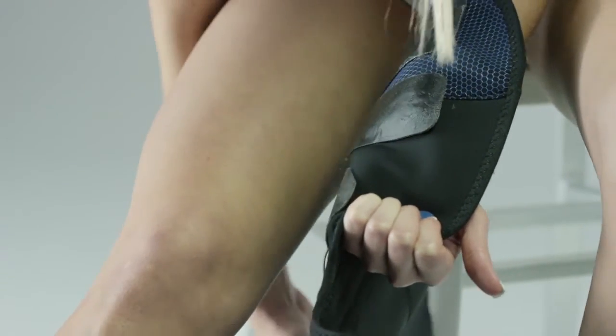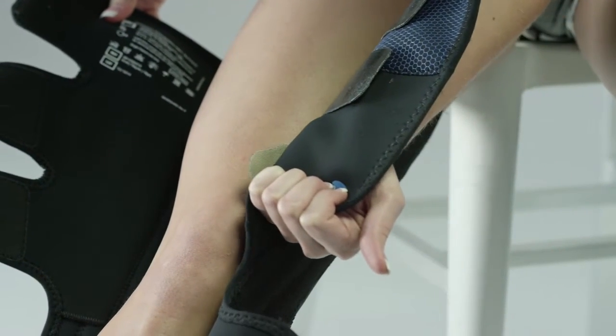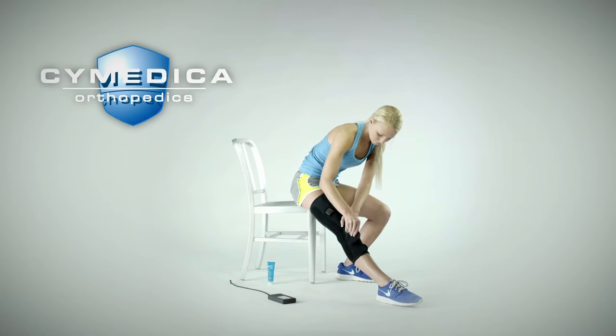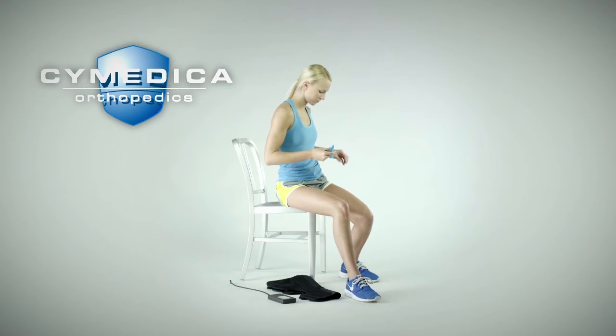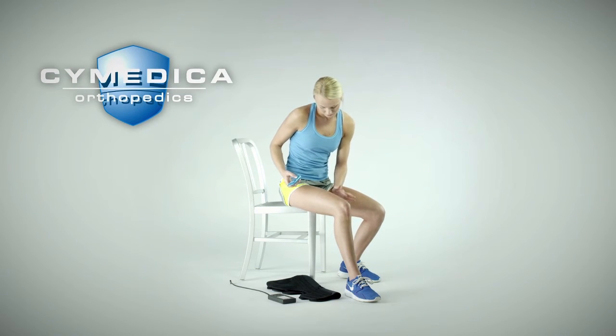The wire can be tucked back into the exit hole to remove any excess wire length. Once electrodes are positioned appropriately, tighten and secure the three wrap ends on the thigh portion and the two wrap ends on the calf portion. When ready to apply the NMES stimulation, wash and dry the skin and apply electrode gel to the electrode areas on the skin.